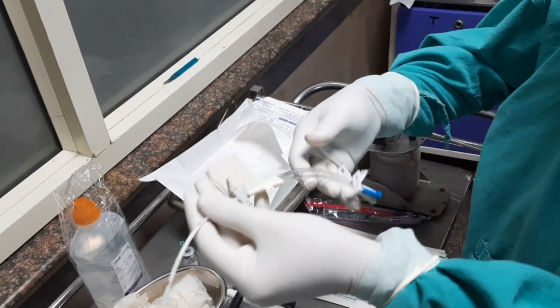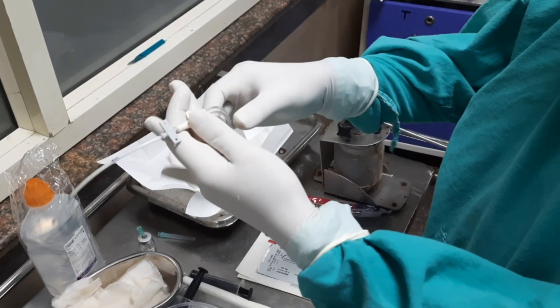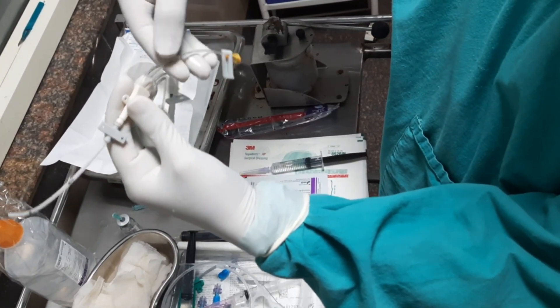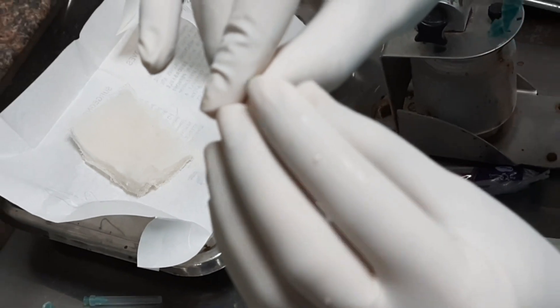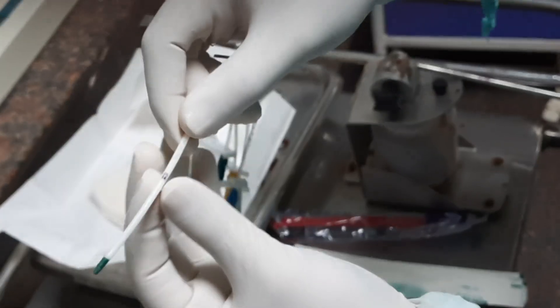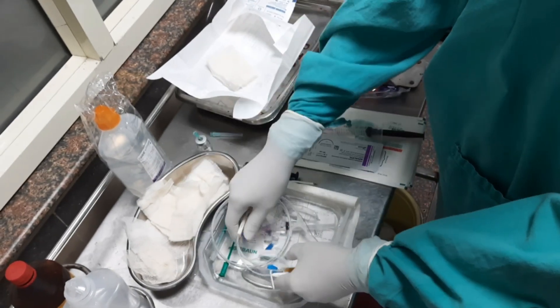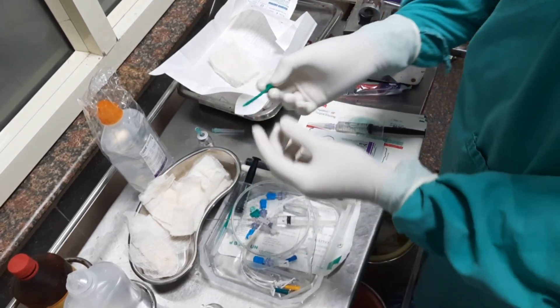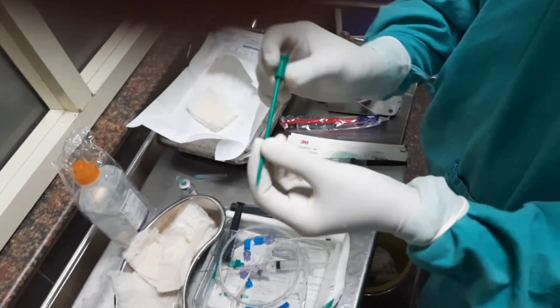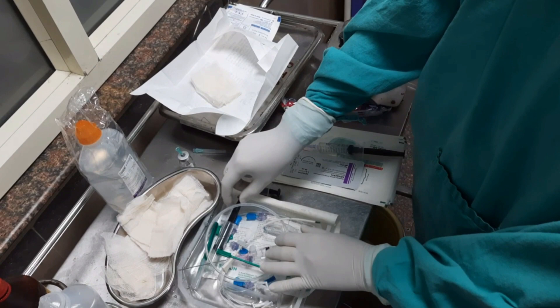This is the four-lumen central line. The four lumens — green, yellow, blue, and white — are all marked with length and flow rate. The yellow port connects to the distal port. It has four ports: distal, one, two, three, and four. These are the caps we will screw on after insertion. This is the dilator — after putting the guide wire we will dilate the lumen with this dilator. Prior to insertion, remove air and check patency with heparinized solution in all ports.